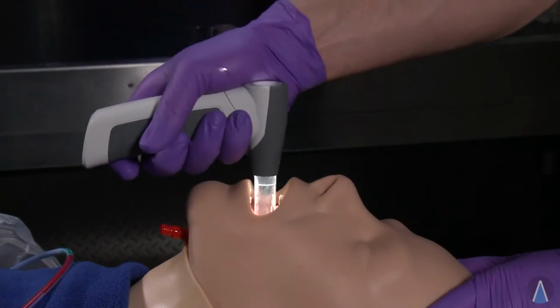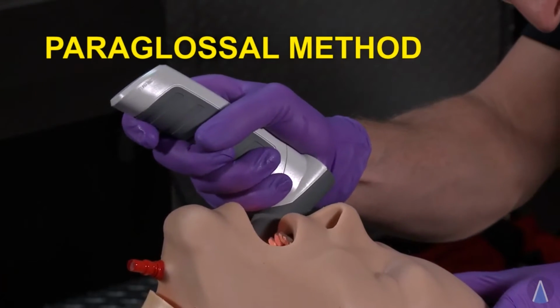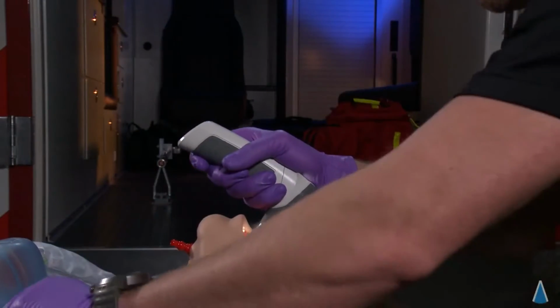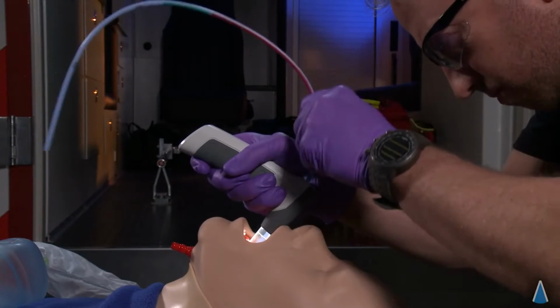In the event of trauma or the need to avoid the front teeth, the paraglossal approach can be used. The V-scope can also be used for seated patients that cannot be moved. Review this video as needed, then practice on a mannequin, and turn in the training checkoff sheet to your training officer.